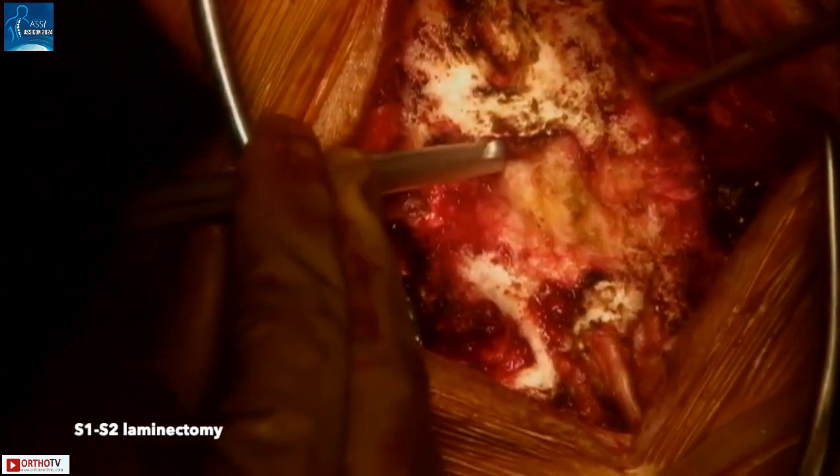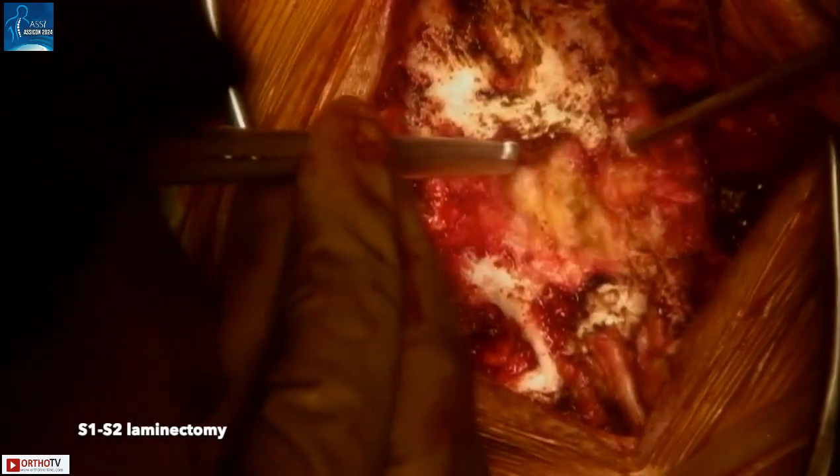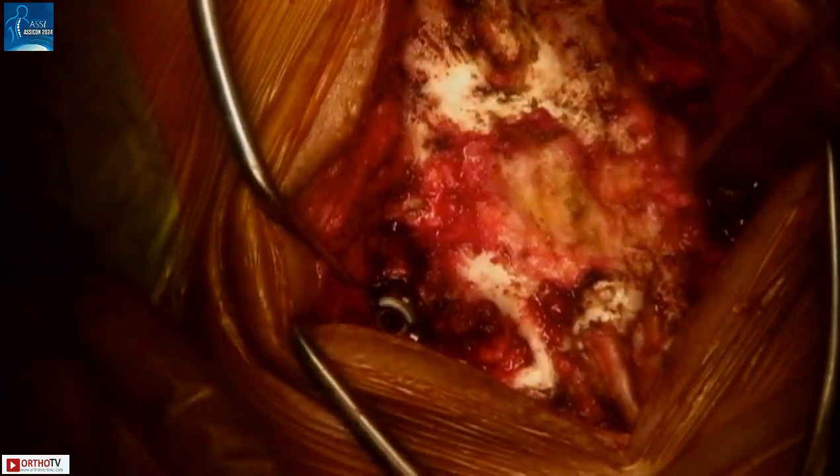Next, a 4 mm Kerrison punch is used to initiate the laminectomy of S1. The intention is to remove adequate bone all the way down to S2 so that the S1-S2 disc can be exposed.